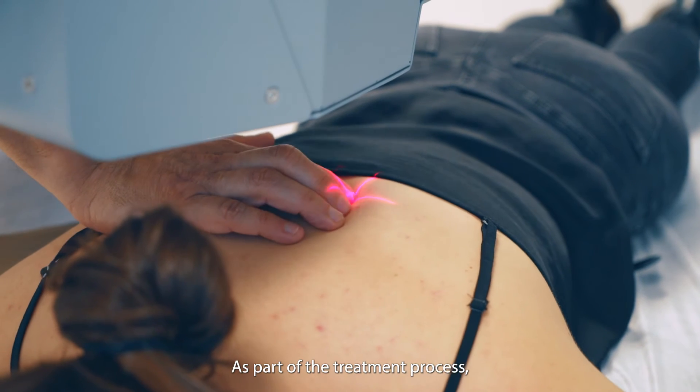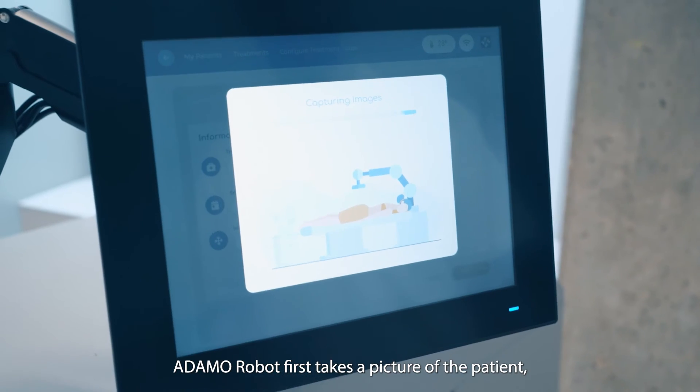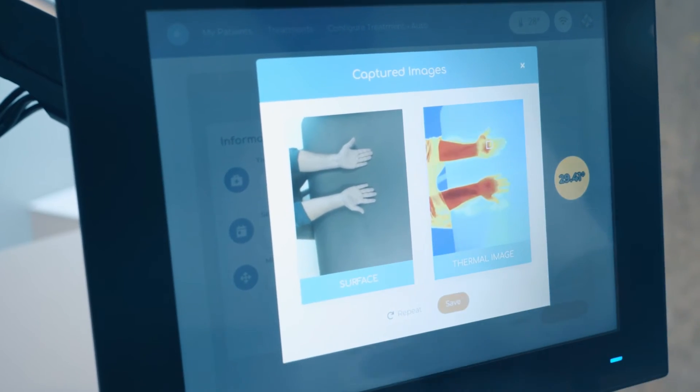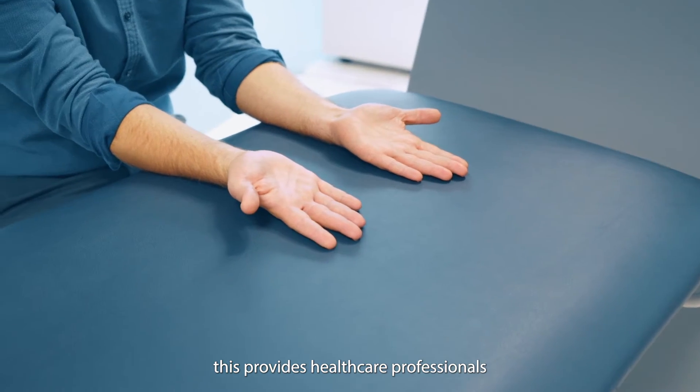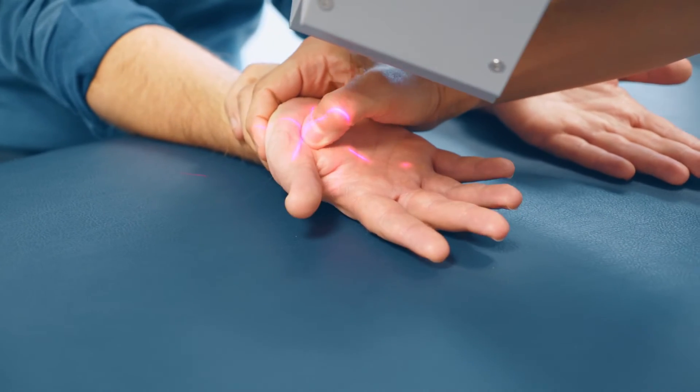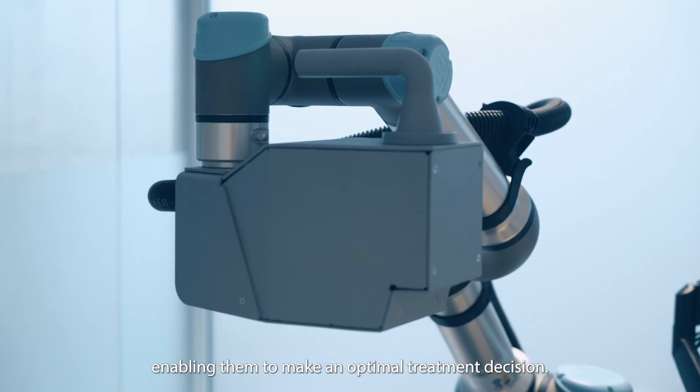As part of the treatment process, Adama robot first takes a picture of the patient using its thermographic camera. This provides healthcare professionals with a thermographic image of the area to be treated, enabling them to make an optimal treatment decision.